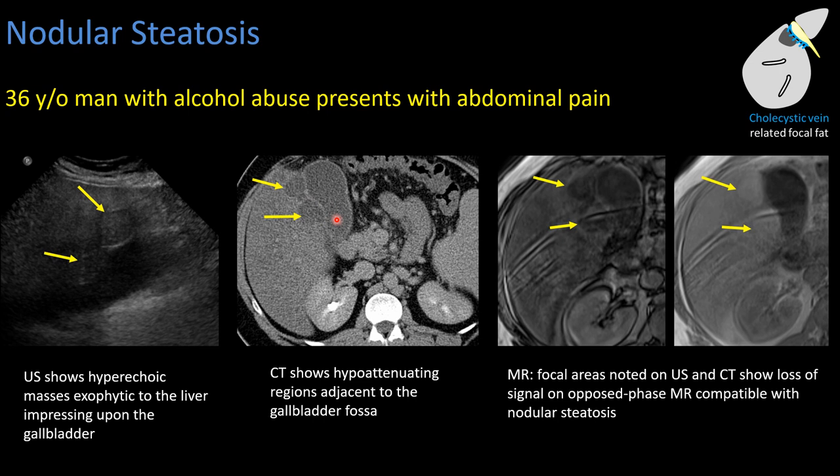While some neoplasms may contain diffuse fat, they are relatively rare. On MRI, these were found to be areas of focal fat deposition along the gallbladder fossa — nodular steatosis. In general, focal fat should not have mass effect and vessels should pass through it, though there are unfortunately exceptions to almost every rule.